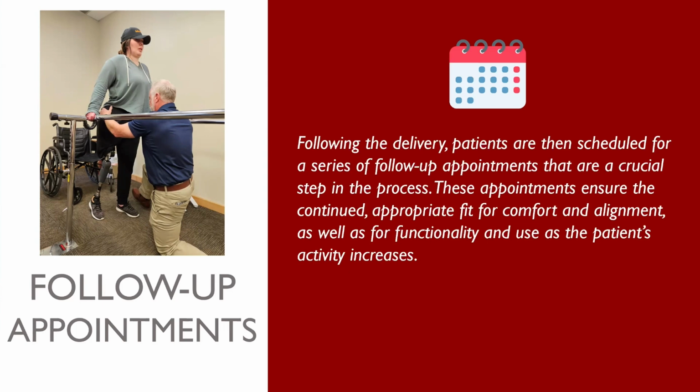Once we see that they're becoming more stable, we'll bring it out to 3 weeks. And then once they're stabilized and we see very little changes, it's time to refit them with their definitive prosthesis and utilize all that experience they have to be a better team member and everything that they've learned from you, because now they're probably discharged from therapy and at the end of this initial prosthesis, and they're out doing things out in their life. And we start testing that definitive leg outside of our office, in their activities of daily living.